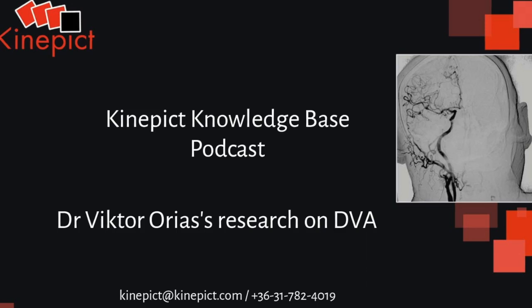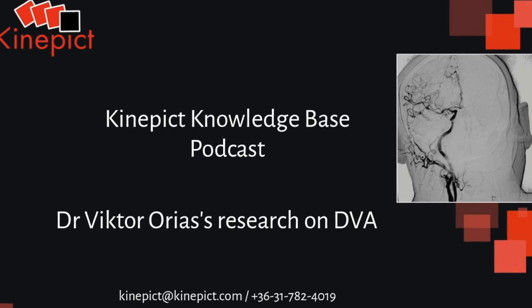2 comparisons were made. Firstly, the post-processed DVA images and the DSA images were compared. Secondly, the evaluators rated the generated images individually and randomly using the previously mentioned 5-grade scale with clear descriptions for each grade, namely 1 meaning poor image quality that is unsuitable for diagnosis, all the way to 5 meaning outstanding image quality that is rich in detail compared with everyday routine, further supporting decision making.